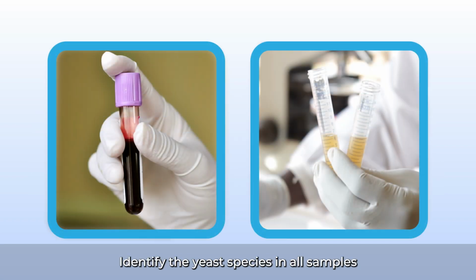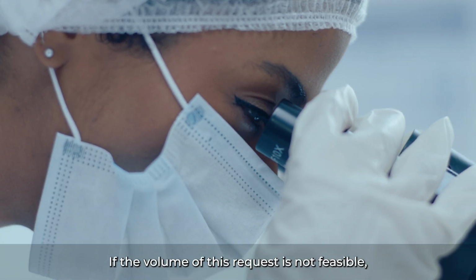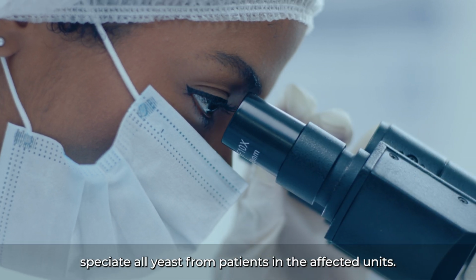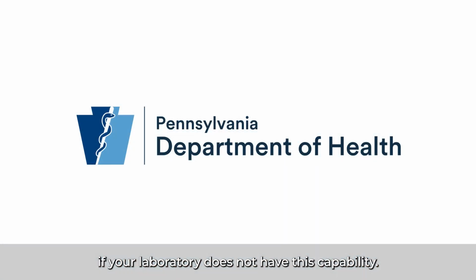Identify the yeast species in all samples collected from patients at your facility, including those from both sterile and non-sterile sites, even if this is not standard practice. If the volume of this request is not feasible, speciate all yeast from patients in the affected units. Discuss options for yeast speciation with public health if your laboratory does not have this capability.